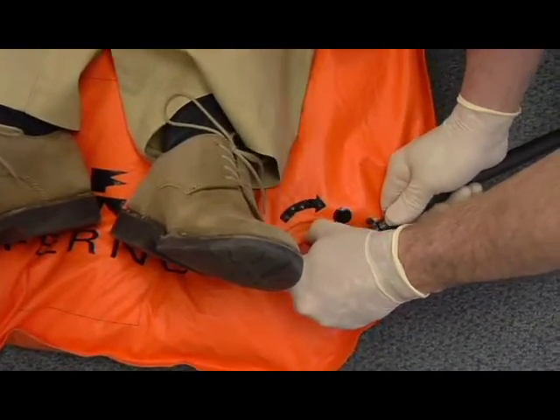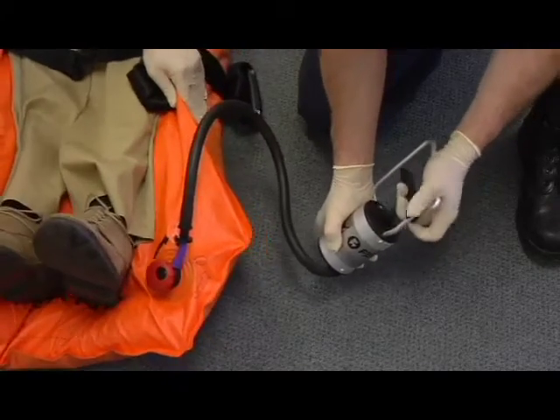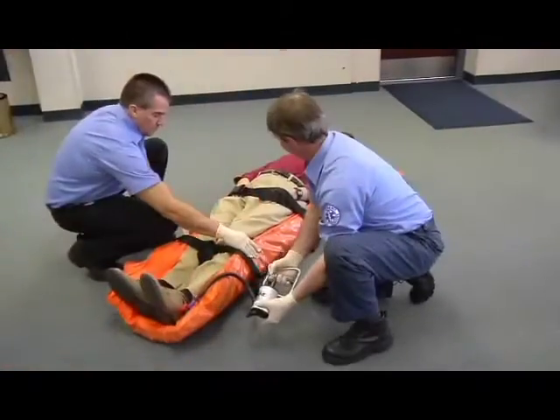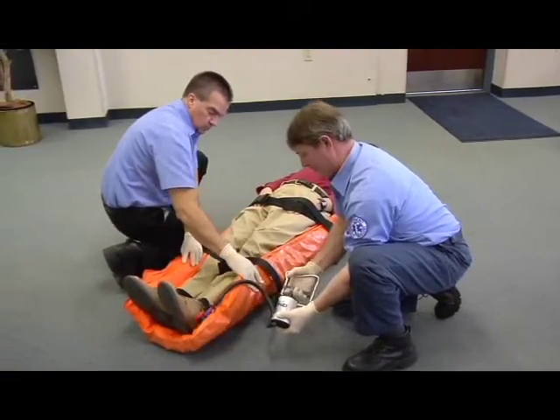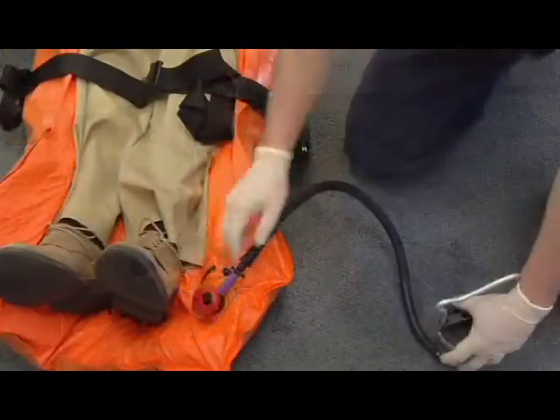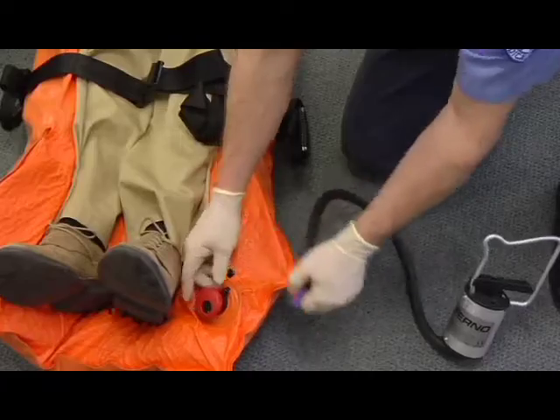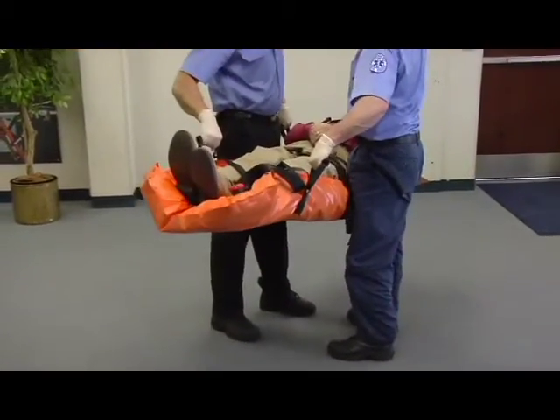Connect the vacuum pump to the valve stem and begin removing air from the mattress by operating the pump handle. As the air is drawn out of the mattress, mold the mattress around the patient. Continue until the mattress is as rigid as desired. Disconnect the pump and tighten the valve as needed. Use the carrying handles to lift and transport the patient on the mattress.